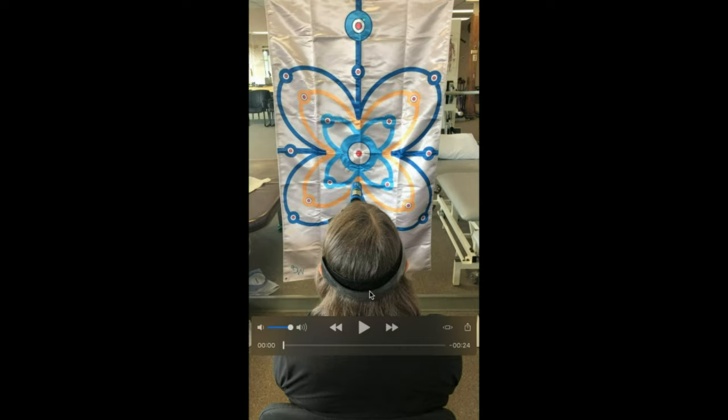She has the middle to large size band on her head, and she has the perpendicular mount with the green laser on. Now, for initial testing, I have them look at the center target here. So that's where their fixation is going to be for the VOR. I have the laser up here. You can kind of see the green dot up here. And that's going to give me a representation going back and forth of what her VOR quality is, the distance side to side, and if there's anything else I need to kind of check out there.